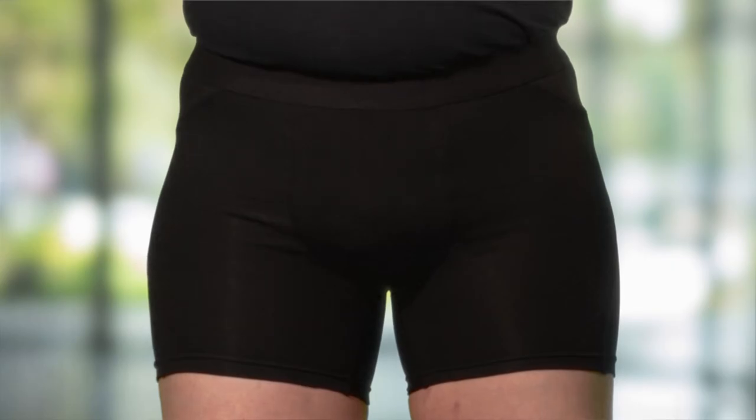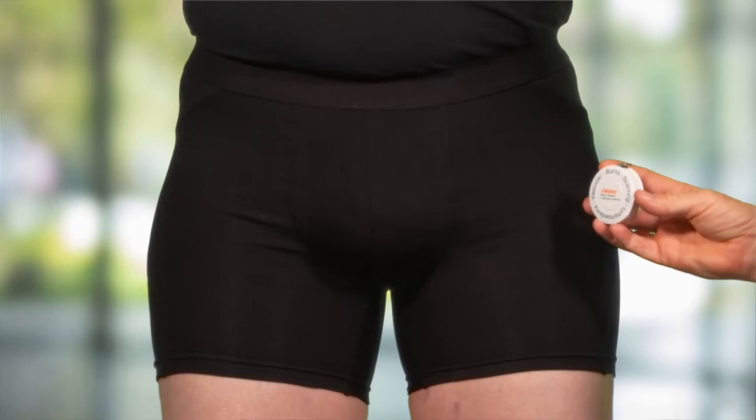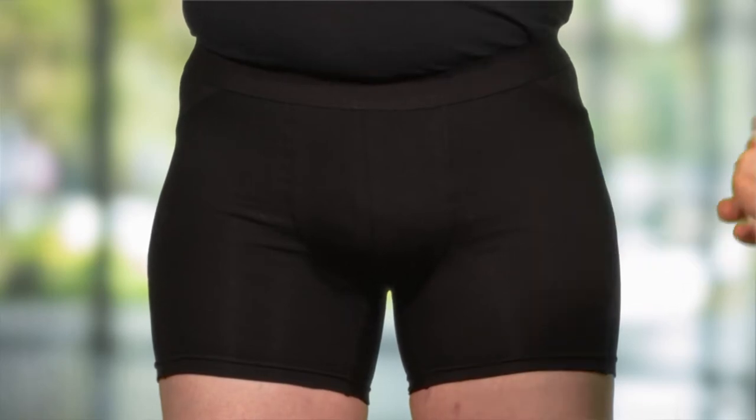Only six measurements are required for the scrotal support and are taken using a Job skin retractable tape measure. The patient should wear underwear or an interim support at the time of measuring. If this is not possible, the penis and scrotum can be lightly bandaged or cling wrapped to simulate the position they would sit in the support.